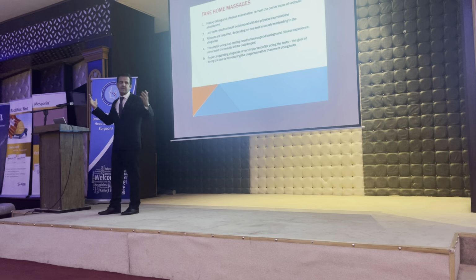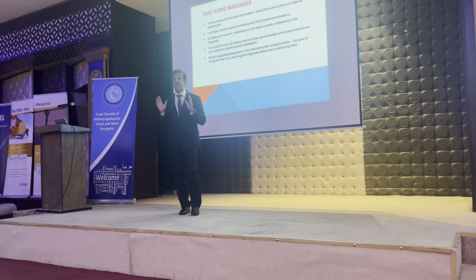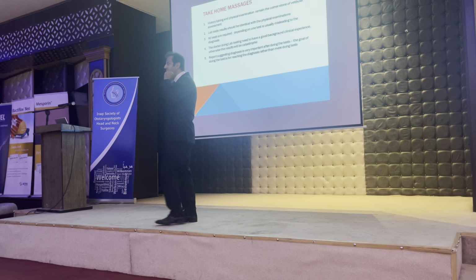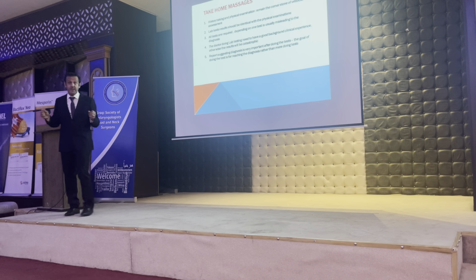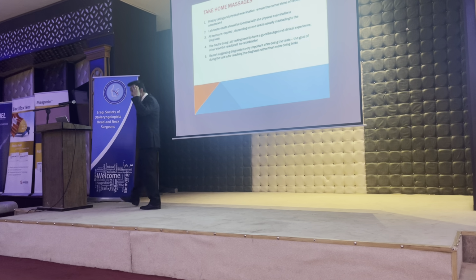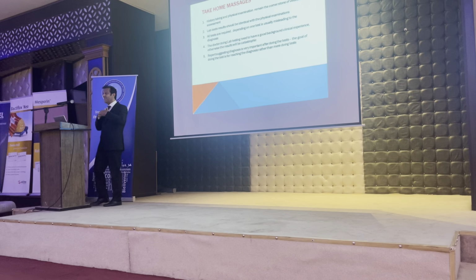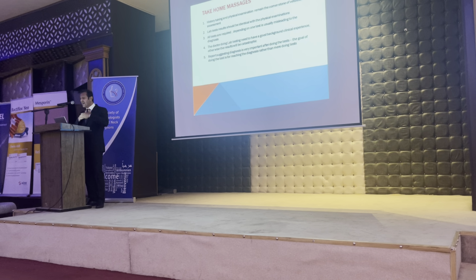What's that? This is something wrong. There is something wrong. No, it's the same. It's the same with vestibular lab testing. If you are fully confident with your history and your art of physical examination, and you get something, you should correlate it with what you get with the vestibular lab testing. So it should be identical.